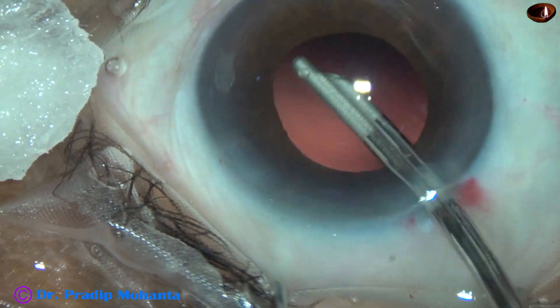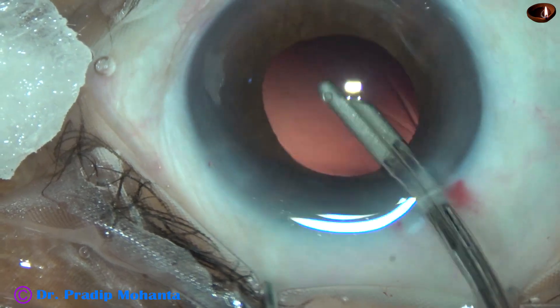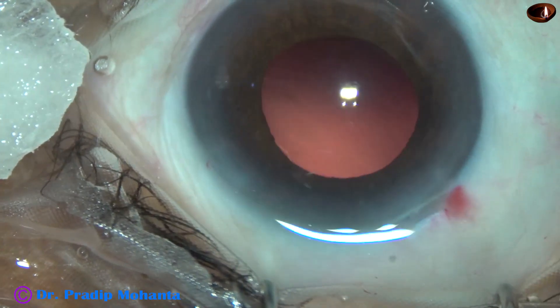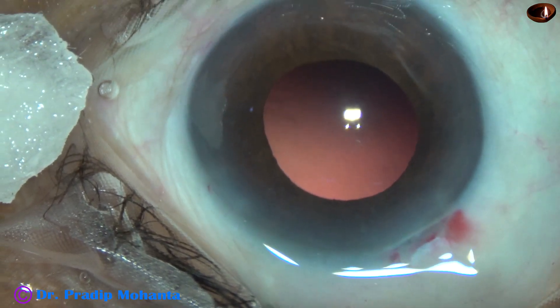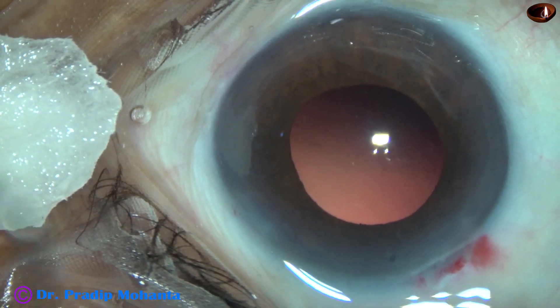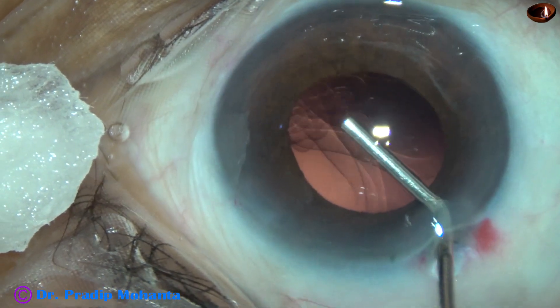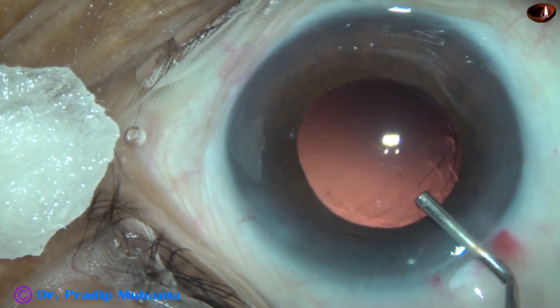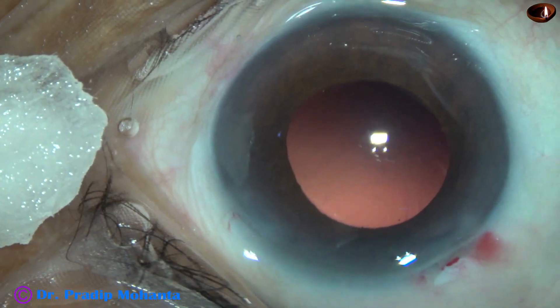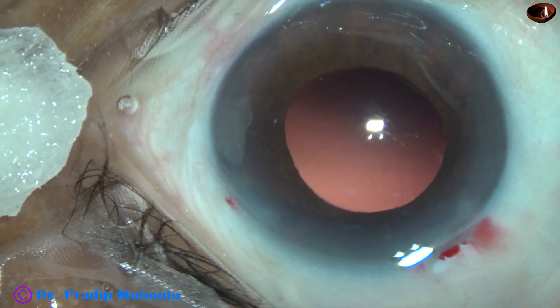The posterior capsule is clean and in this case we have selected a very good intraocular lens — this is Tecnis 1 from Johnson and Johnson. This is my favorite lens; I have no financial interest, but this lens is really good. It doesn't develop micro-vacuoles over a period of time — what I mean is there is no glistening in this lens over a period of time.